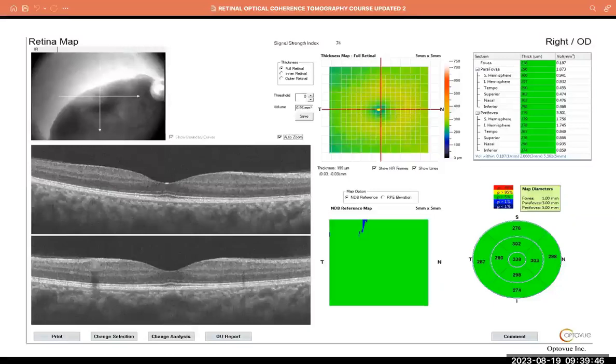That will give you an understanding of the state of the patient at the time they presented to you, and that will be the data for monitoring. Because when you repeat the test in the same machine, you can run the analysis and be able to compare if there is a progression.